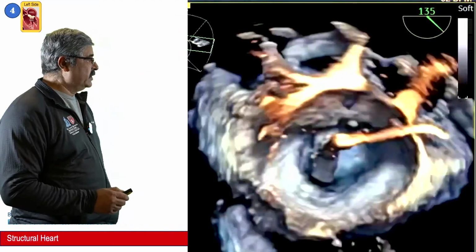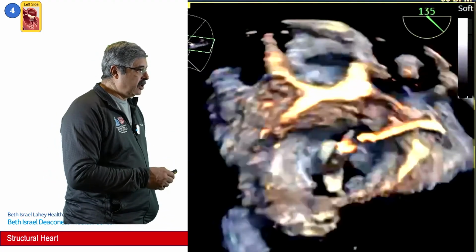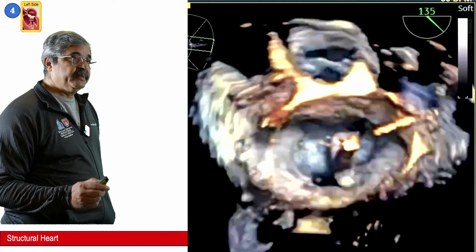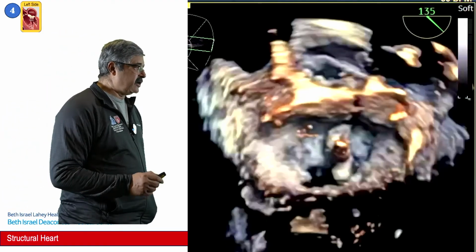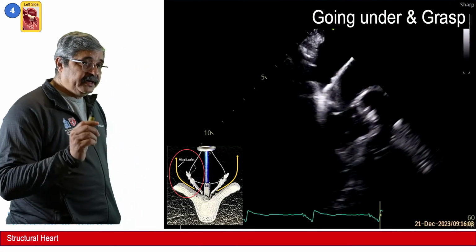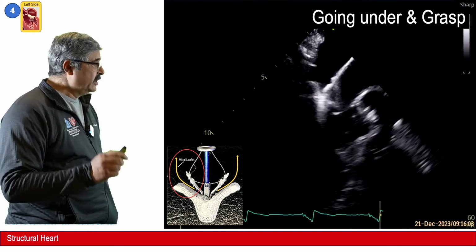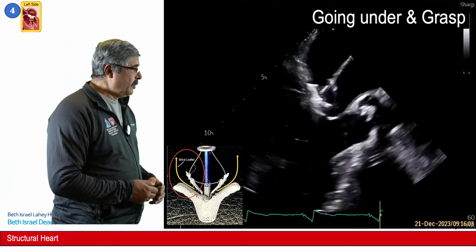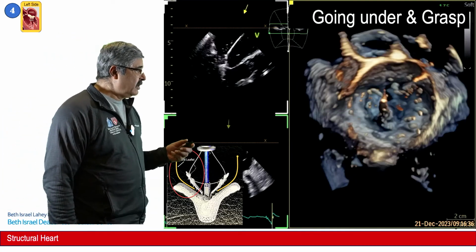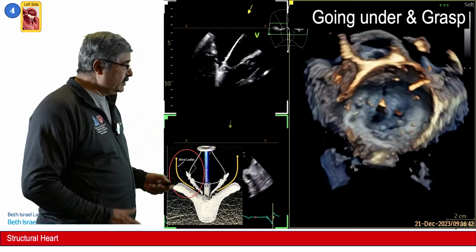And if you want to look at it in real time, you see the clip is very anterior. We are telling them to rotate it counterclockwise, move posteriorly, and move medially. And as you can see in real time, this clip is moving to the exact target that we wanted it to be. Once you have identified that you are above the valve and in the right location, then you cross from up top into the bottom. As you can see here, the clip is crossing and going below. This is done in real time to show that you do not drift medially or laterally.